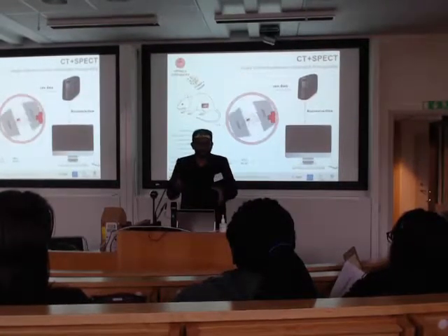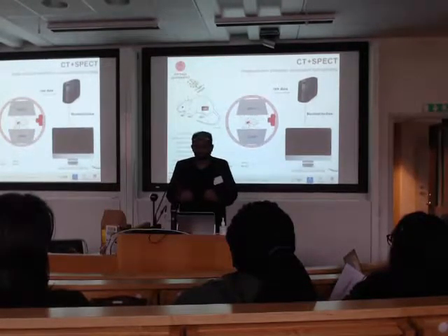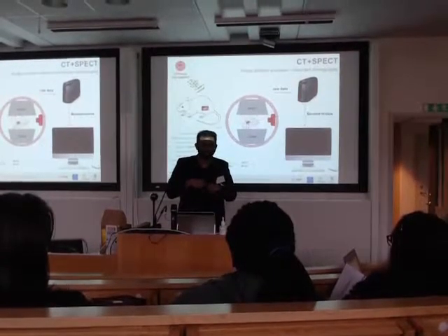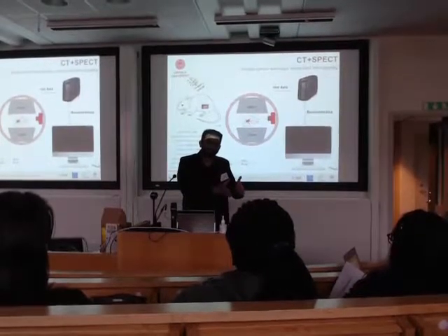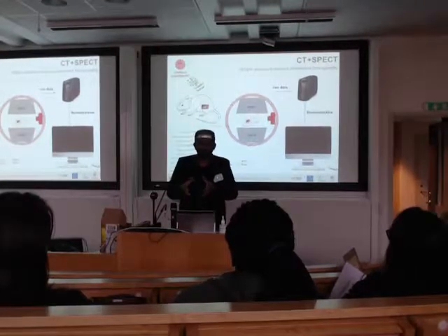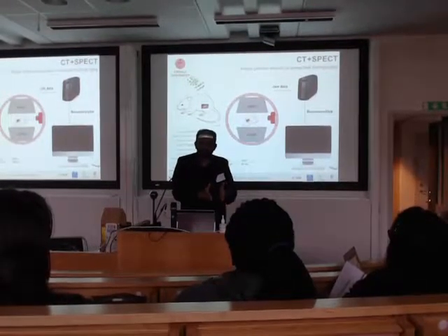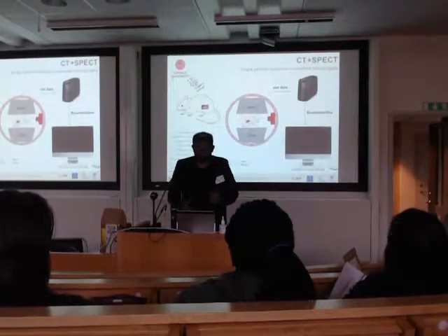So these 2-head cameras rotate around the animal and try to accumulate as many of the gamma rays as it emits. Here I just want to emphasize that this radiation is coming from the already incorporated radionuclide in the surgery spot, this iodine-125. We are not injecting anything at the time of SPECT scan. So we position the animal with CT, we follow the iodine-125 protein with SPECT, and now we want to see how the bone is growing, the rate of bone regeneration. These are all taken on the same day. First 5 minutes CT, the next half an hour is SPECT. Then we move the animal towards the PET gantry, and we do a PET scan.